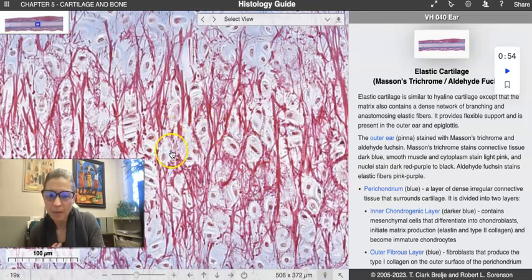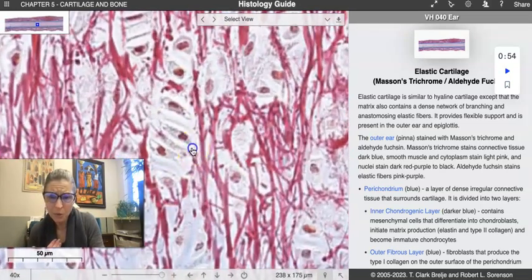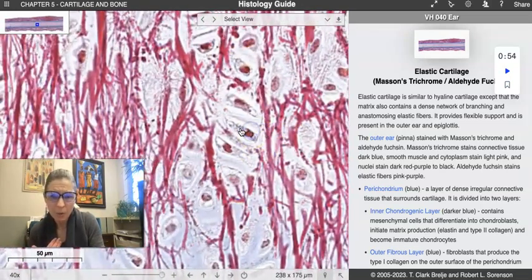And so the cells that we see here, and as we go along, even if we were to zoom in here, that's kind of a perfect one. You can see the nucleus. Here is the cell itself. And then there's a little bit of this white around it, and that would essentially be the lacunae, right?